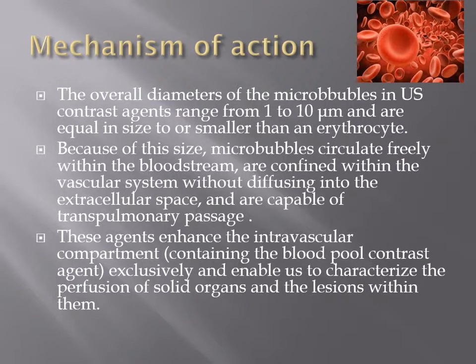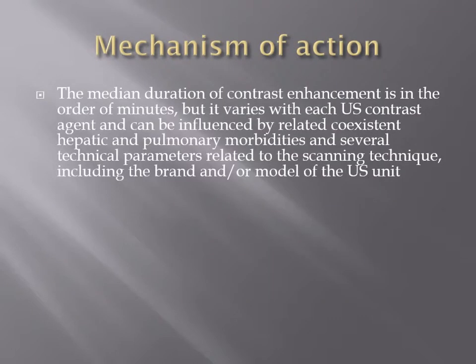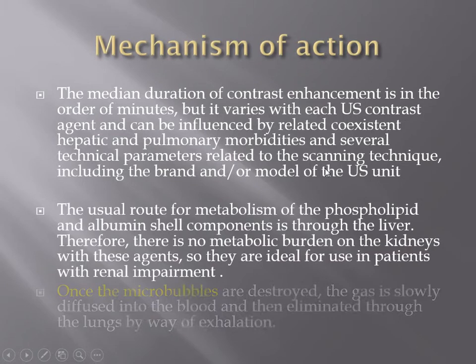Now, these agents enhance the intravascular component exclusively, as blood pool contrast agents, so we can better see the lesion and also characterize the perfusion of the solid organs at that time. The good thing is that the mean duration of action of these agents is on the order of minutes, but it varies according to the ultrasound agent. It can also be affected if the patient has hepatic or pulmonary comorbidity, because the bubbles reach the lung and are exhaled. I will show this later. It will also be affected by the technical parameters of the device itself.